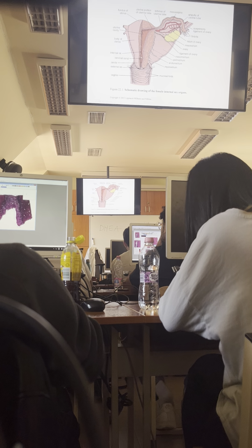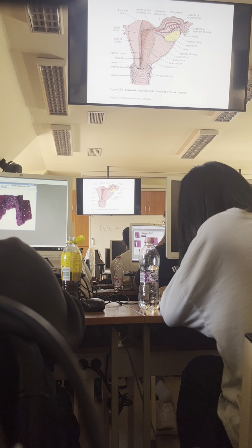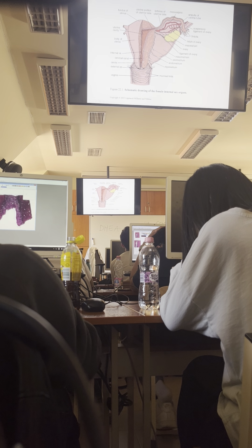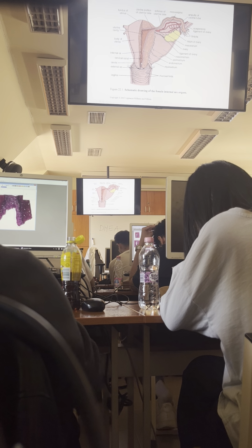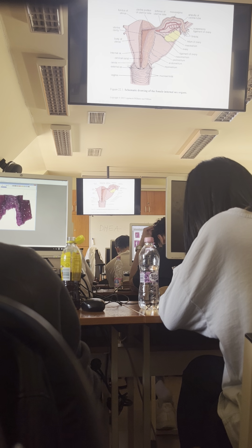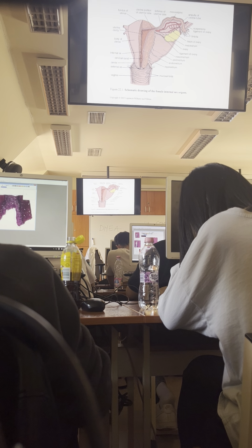And this narrow barrel-shaped territory is called cervix. Now, the cervical part is not so hormone sensitive relative to the other parts. All sections are from the body part, probably, because it shows real hormone sensitivity. We see the differences between the two phases.